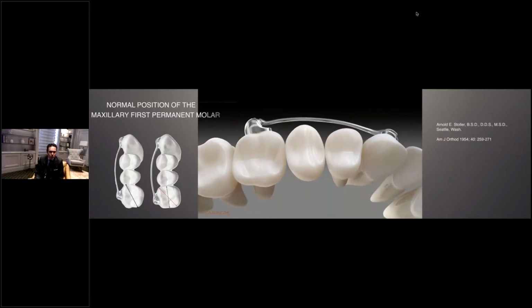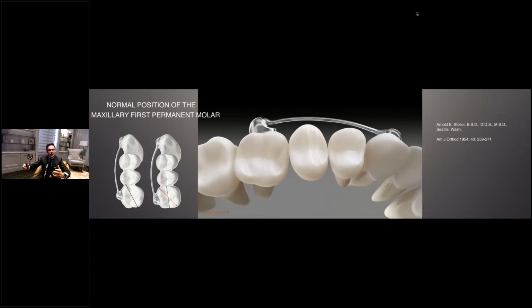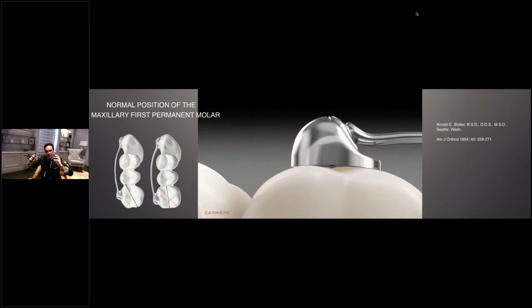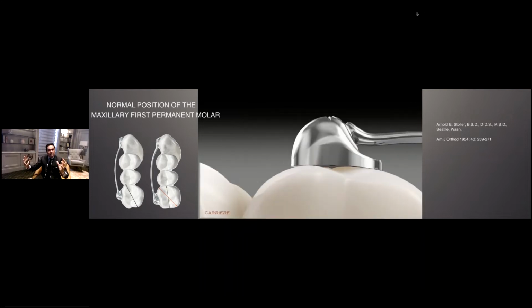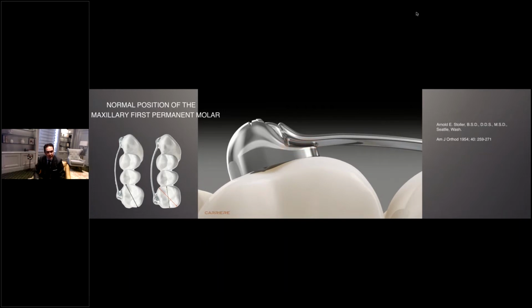We are going to talk about how to solve the sagittal problems using the Motion appliance. This appliance gives us the possibility of moving the posterior segments in a block into class 1, accomplishing class 1 occlusion of the canines, premolars, and molars, and at the same time rotating the molars, but avoiding any kind of over-rotation thanks to the self-engineered collision points established in the design of the molars.